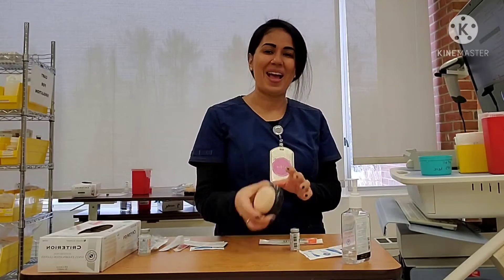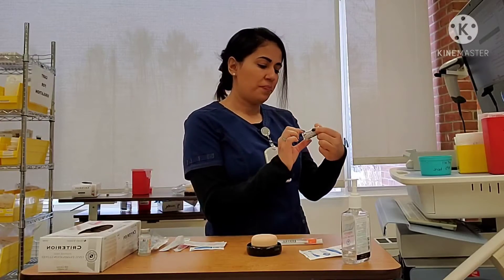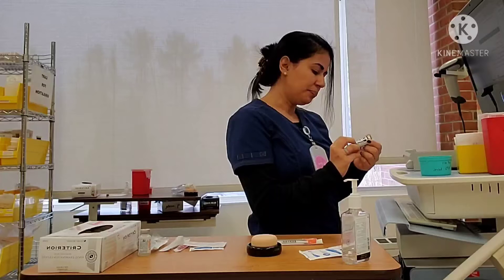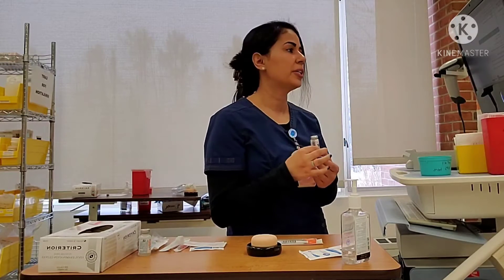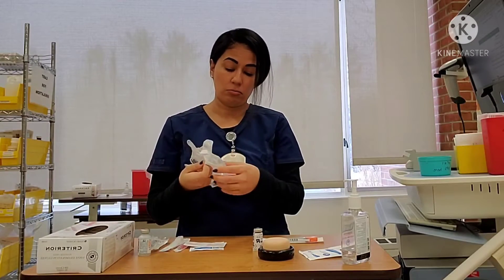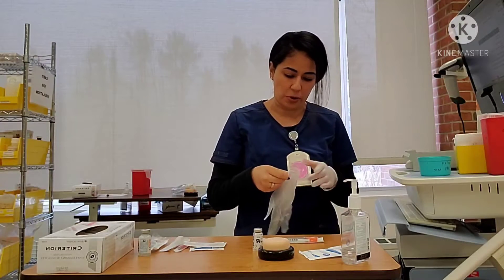For the purpose of my sim lab, I'm going to be using this injection pad to demonstrate the subcutaneous injection. Now I'm going to check my medication and make sure I have the appropriate medication for what the provider ordered. I have my regular insulin, it's not expired, and it looks good — regular insulin should be clear. I know I want to administer four units. You don't technically need gloves to withdraw medication, but it's something I feel more comfortable doing as part of my practice.